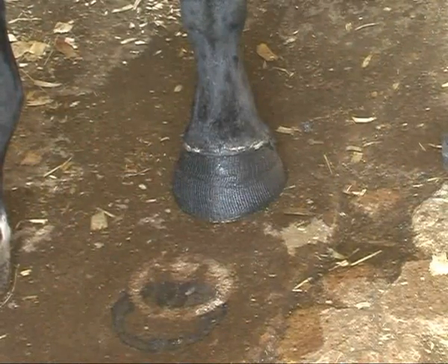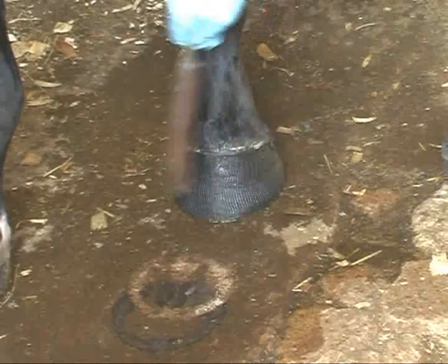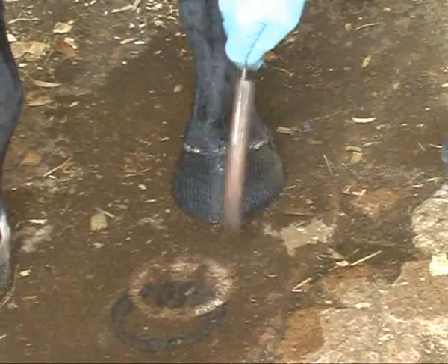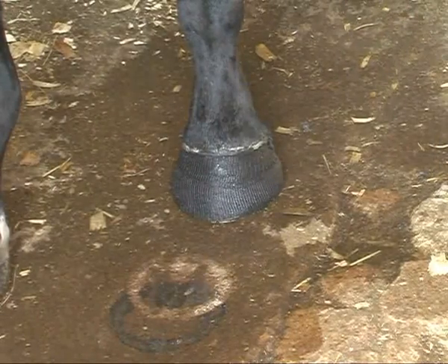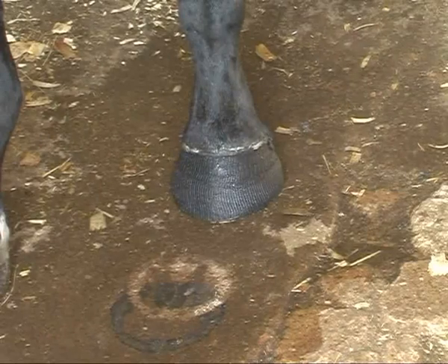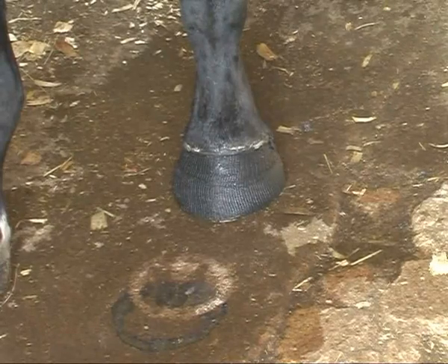This cuff has now been on for four minutes. It's not as hard as it's going to get, but it's certainly hard enough for us to think about putting a shoe on it. I've turned the foot up and cut out the overfill of the bandage across the sole. The rest will come out when I cut out the V to allow the heels to open and shut with the motion of the horse.